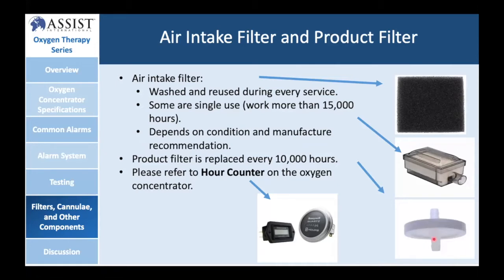This is a little bit of an involved process. Your biomed teams should be able to do it, and we're happy to show them how to do it if they don't have that type of training. Please also track the hour counter on your oxygen concentrators. Most oxygen concentrators will have hours listed on there. As Maz mentioned, the zeolite tanks, the sieve beds need to be replaced every 20 to 50,000 hours roughly.